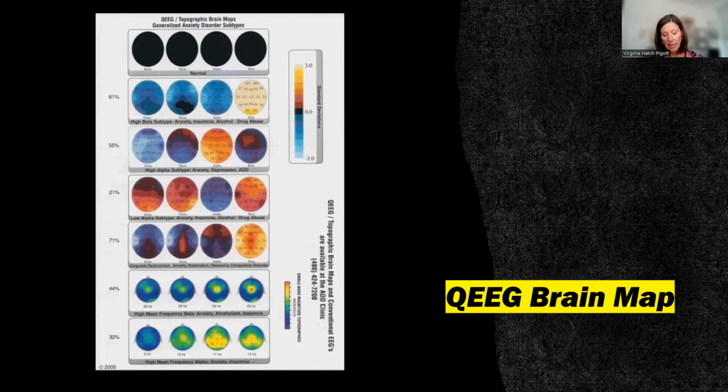So the databases take the power and the amplitude, compare them to controls, determine how many standard deviations away from the mean each brainwave is, and generate this brain map, which is actually a color graph. Brain maps measure electricity in different parts of the brain. And remember, electricity correlates with blood flow.